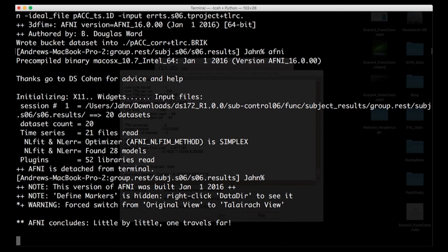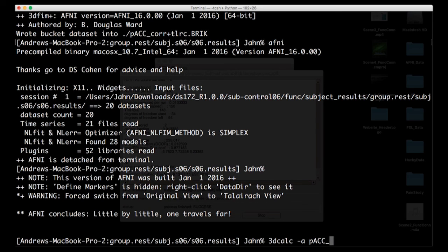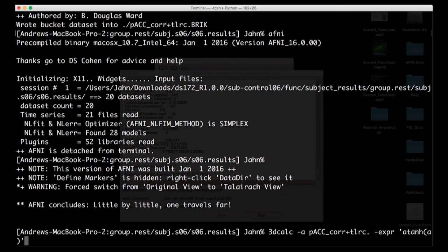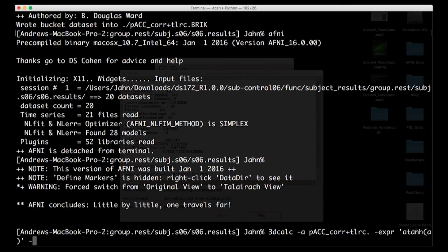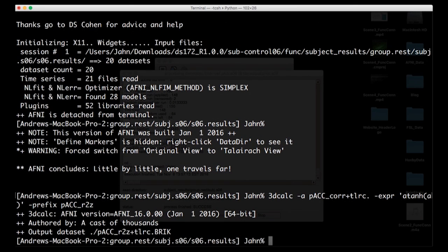So you've done it. You have detected the resting state default mode network. And the last thing I want to have you do as an exercise is then transform that into a Z map or a Z transform. This is called a Fisher's Z transform. I'm using 3Dcalc, which is AFNI's image calculator tool. For my input, it's going to be PCC_cor. And the expression, the mathematical expression is AtanH. And I'm applying that to that data set. So AtanH is the way that you convert Pearson's correlation coefficients to Z scores. Now, notice the reason we do this is because our values are not normally distributed, but these Z values are. And I'll leave it up to you to check that overlay compared to your correlation map and see how those two things match up.